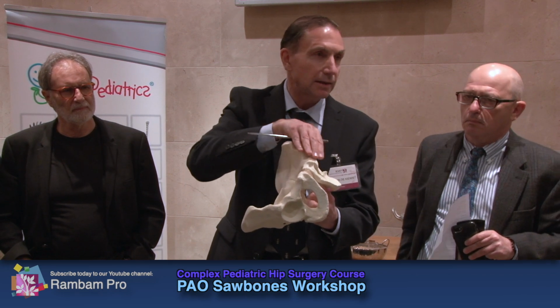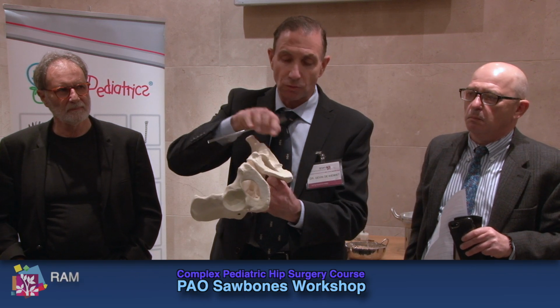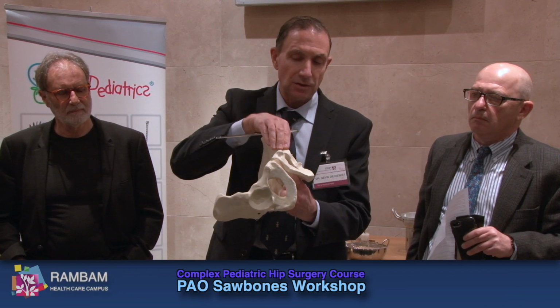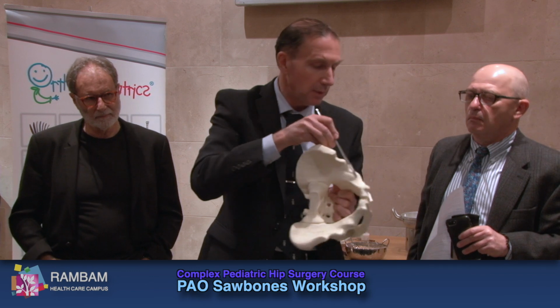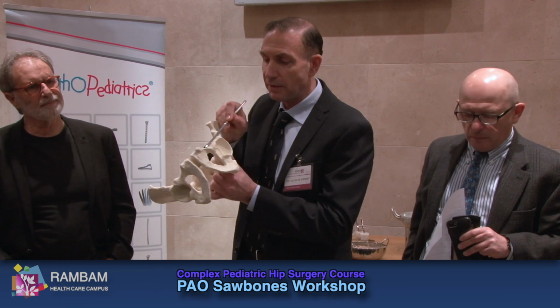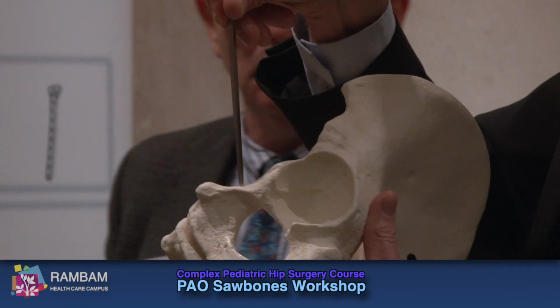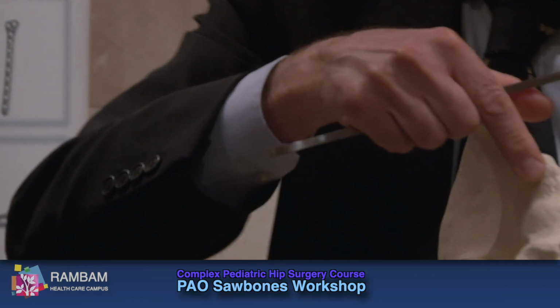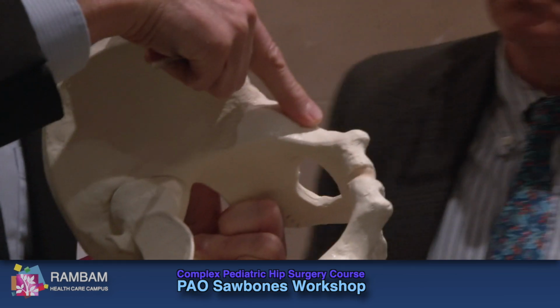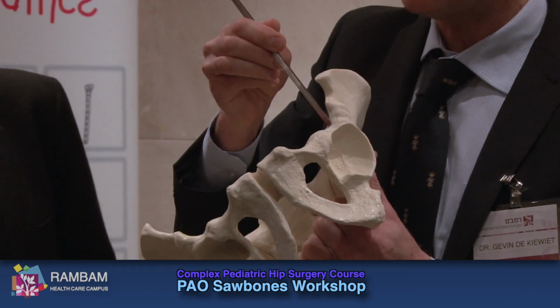You can dissect that, but that will guide you down the medial aspect of the capsule to get to this point. When you get to that, you put your retractor along the pubic rim here, like this, on X-ray control. You can see that point, see, that's a good point. And then put it in at the pubic symphysis like that, lift it up as a retractor. Then you can feel this bump here. With your finger, you can feel that bump intraoperatively.